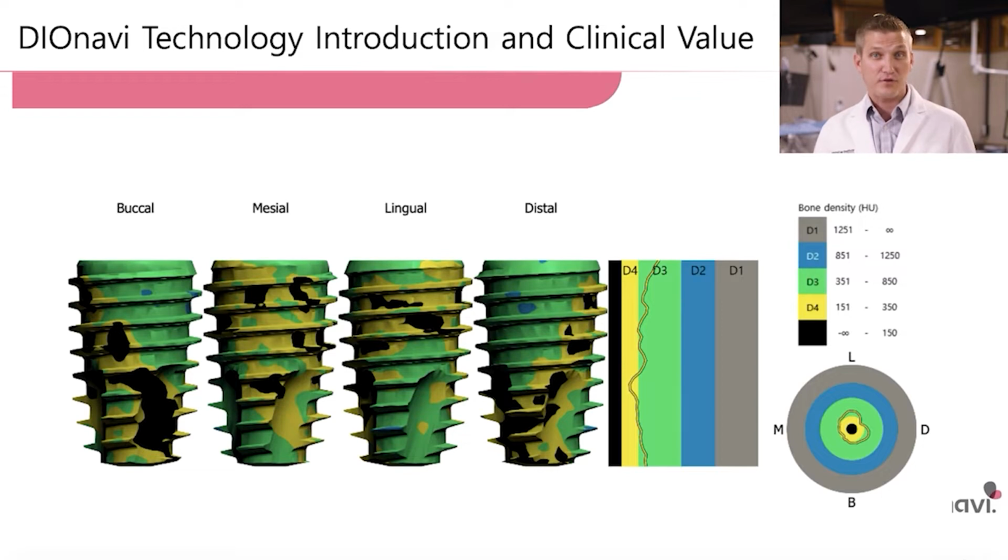So through a Hounsfield unit measurement in the software, we can go before surgery even happens and make some clinical plans based on what the bone density is going to be like. I appreciate that extra boost of confidence to understand what the situation is going to look like clinically. As you know, bone quality makes such a difference in our implant cases when we talk about loading, primary stability. This takes a little bit of the mystique off of that analysis of what is it going to be like.